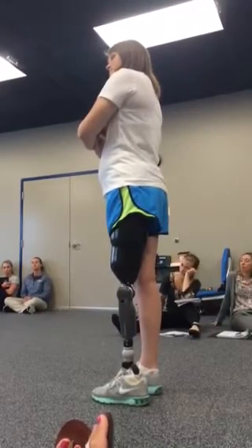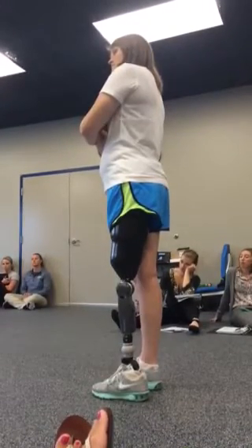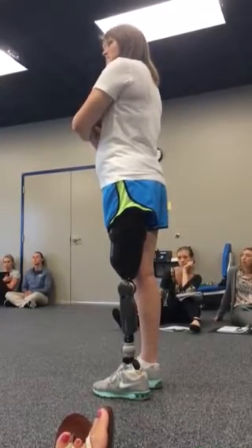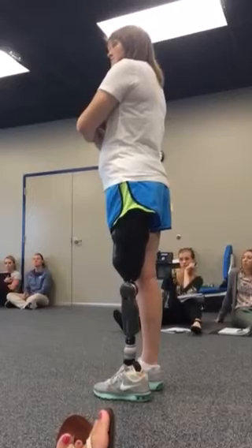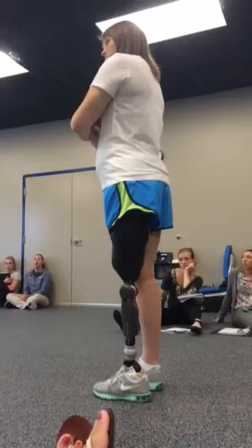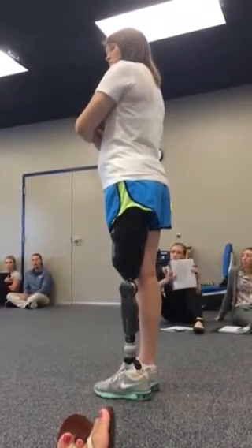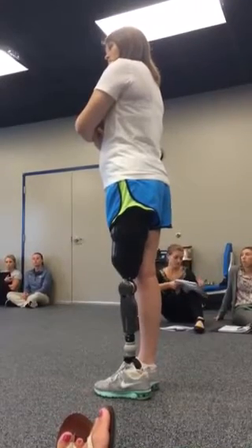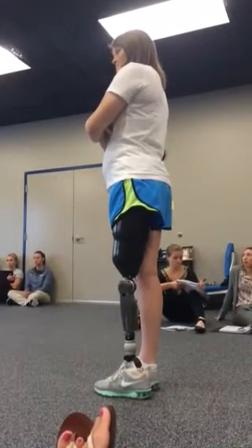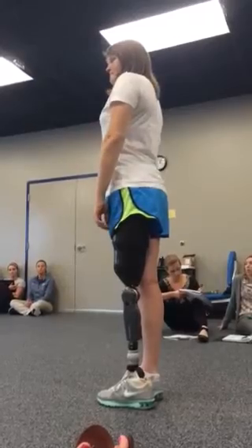And then we're going to look at the toe load, knee flexion, pelvic rotation. One of the ways to figure out if the knee is flexing enough is to look at what we call heel rise. In prosthetics, we call it heel rise. It's how much your heel rises before you actually go into swing. Technically, from a PT standpoint, that's initial swing, because it's initial swing here, and then you get mid swing, and then terminal swing. What you can tell is if her right heel comes up this high, then it would be really nice if her left heel came up that high. So that's a visual cue you can use to see if we're getting enough.